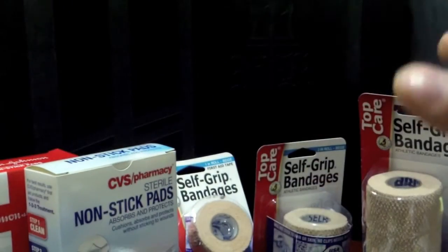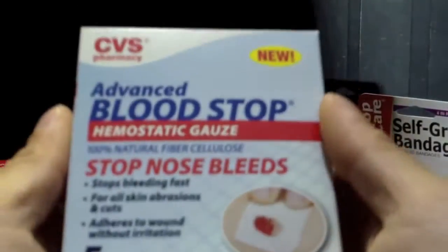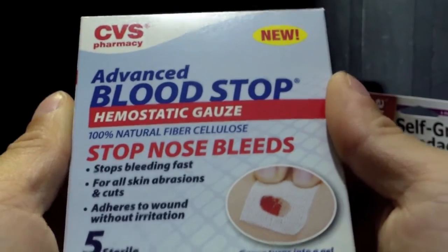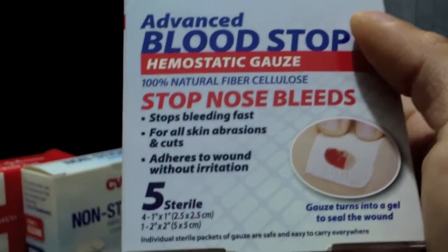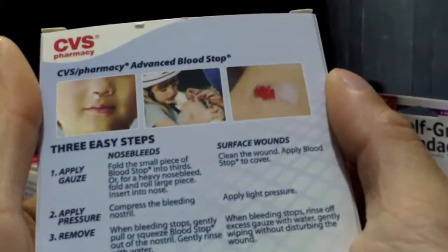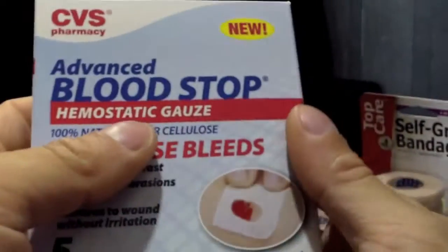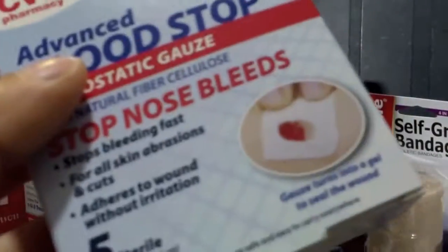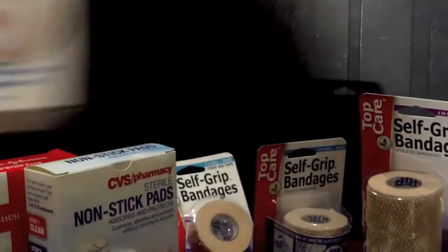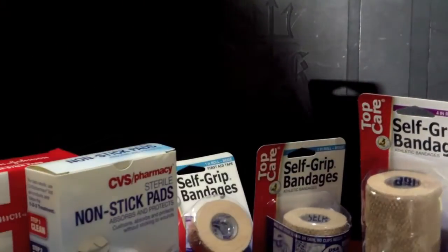And they always say don't remove it until you go seek medical attention. There are these miniature versions now, where there's a little bit of that clotting agent, but this is only a 1x1, and it's also wrapped in paper. So it won't, for example, stop a nosebleed like it claims. I get those frequently with the dry weather out here and wearing the mask from knife making. So these are very ineffective. First, they're small, and two, they don't really clot that well. But again, a similar concept to the Quick Clot in a more minimalistic form.